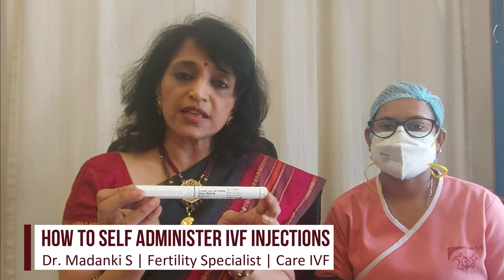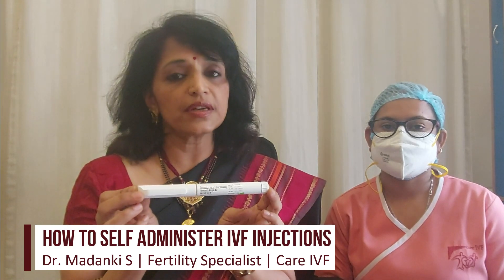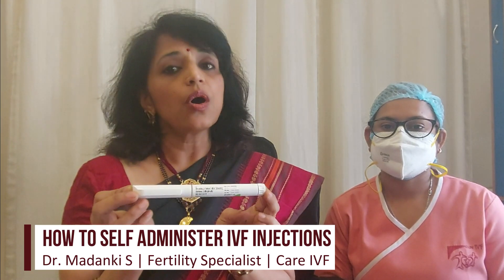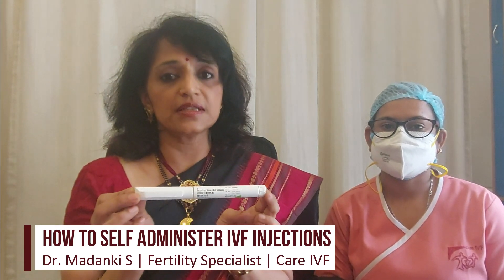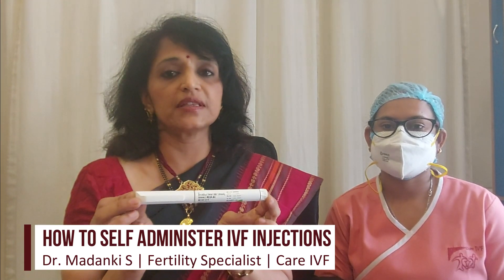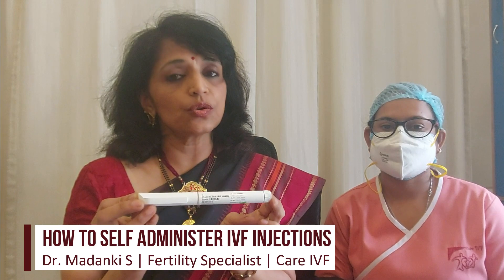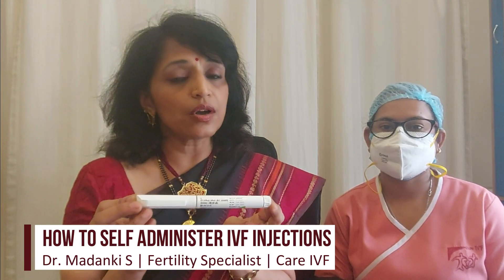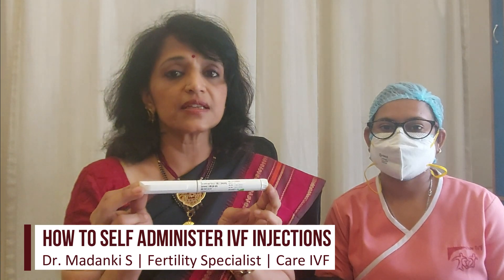It is a challenge for most of you to be able to do this on your own, which is why we are taking you through this tutorial. Although we do have our nursing staff who can administer these injections in the clinic premises on a daily basis, during Sundays or public holidays it is important that you know how to do it yourself, because these injections cannot be missed and have to be taken daily.